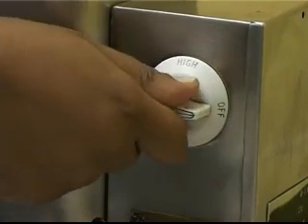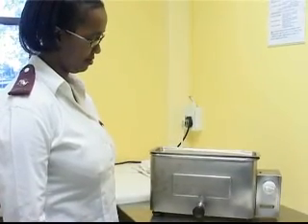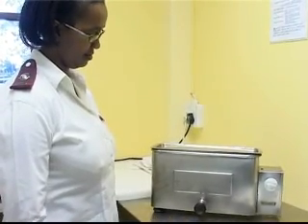Make sure that the water boils. The sterilization time only begins when the water boils. Boil for the required time. Do not leave the sterilizer unattended when it is in use.